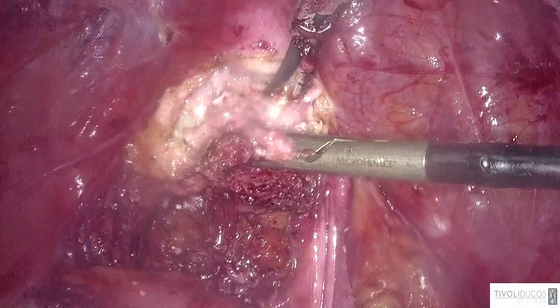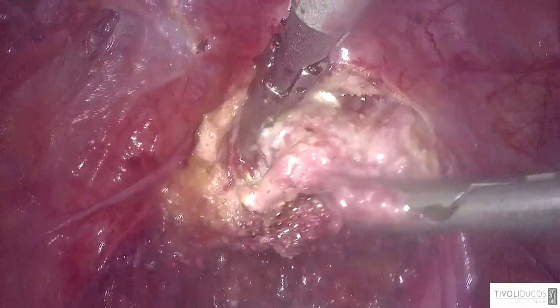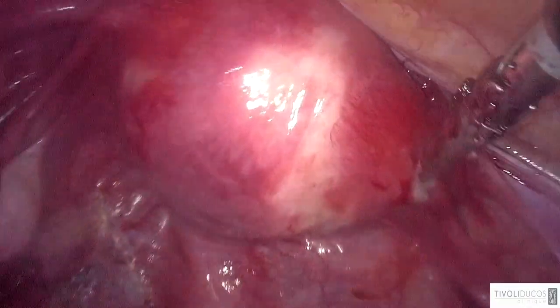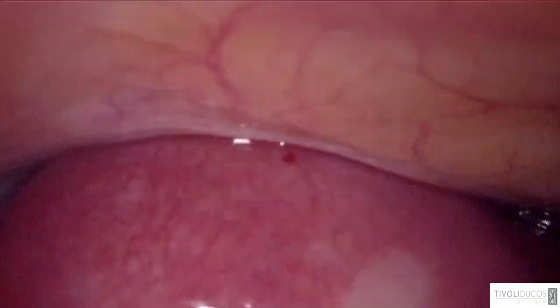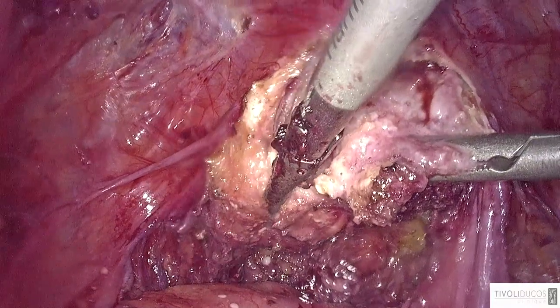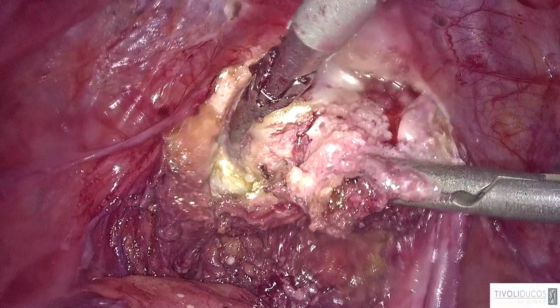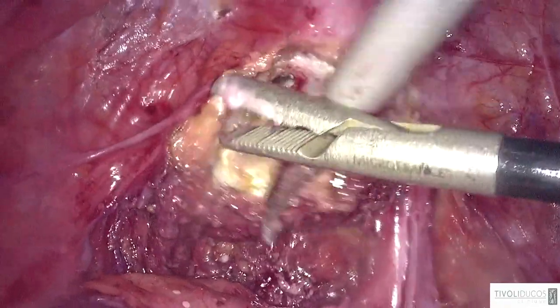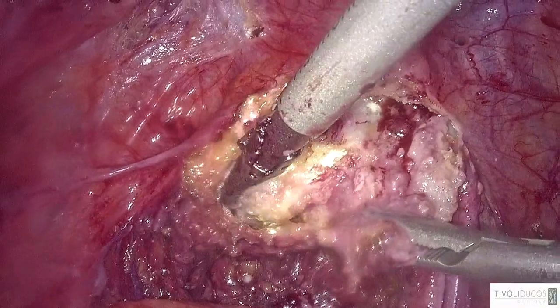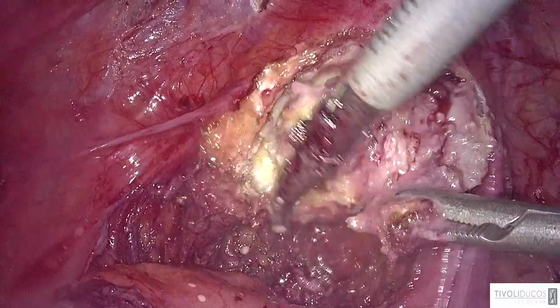So I stopped doing the vaginal approach, but I use all my knowledge provided to the vaginal approach to do it with my finger. So always I use a finger into the vagina. Horace, did I understand well that your finger is in the vagina, right? Yes. So I use only my left hand, but just for this step of dissecting the vagina, because it allows me to see where is the limit of the infiltration.